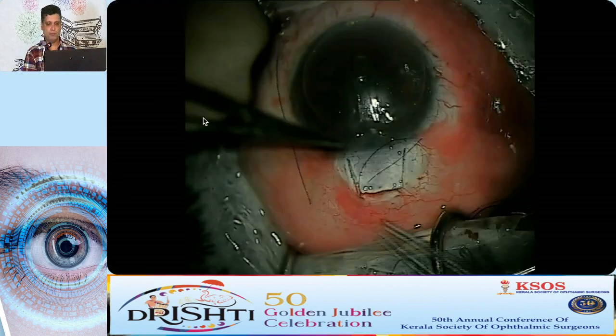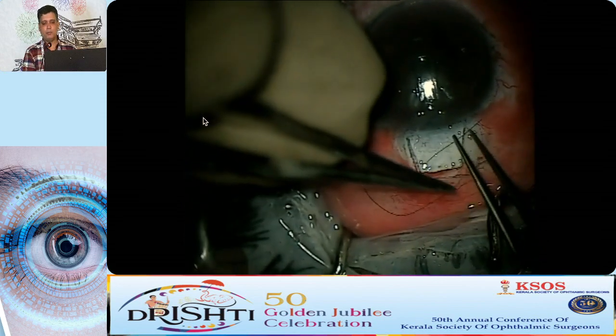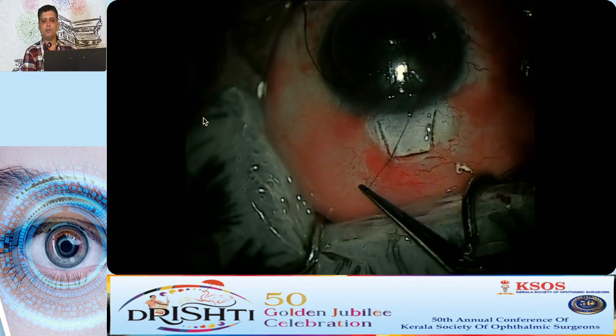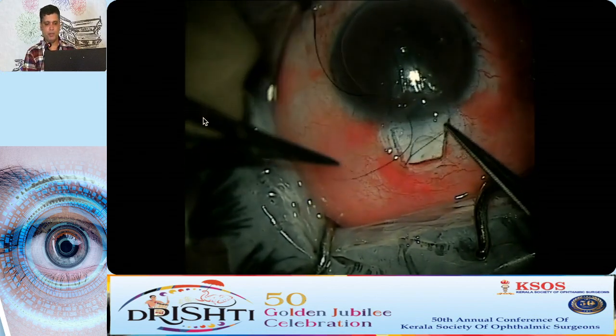Subsequently, for scleral flap closure, I generally use two interrupted sutures at either edges of the rectangular flap and then use releasable sutures. I'll not be discussing releasable sutures because that's again a topic for discussion by another speaker subsequently.